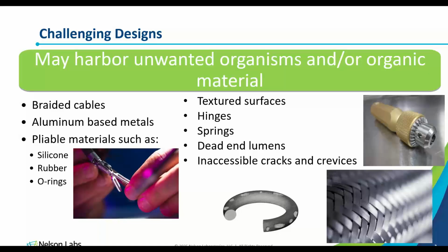It could be that the extraction method used, while not the most efficient, was the only one available based on the design of the device or the size of the device. The device could be so large that perhaps something like swabbing is the only available method. In that case, swabbing is not often the most efficient extraction method, and so it's not uncommon to see recovery efficiencies below 70% when using that method.